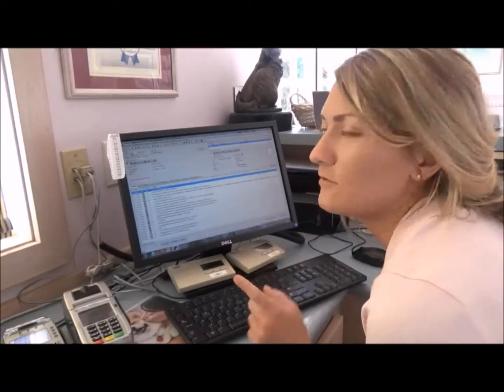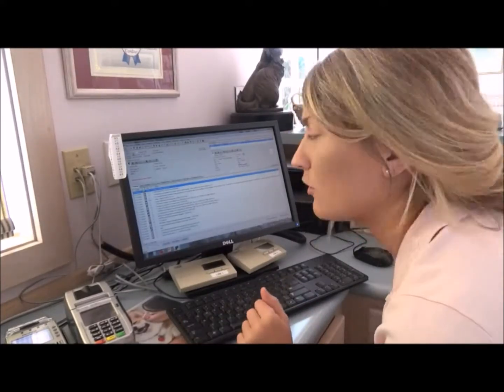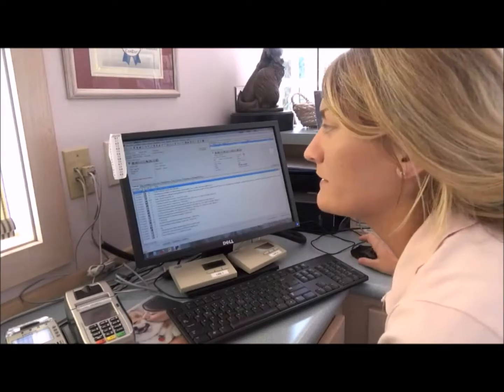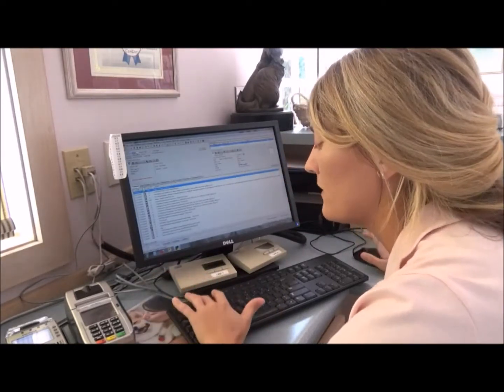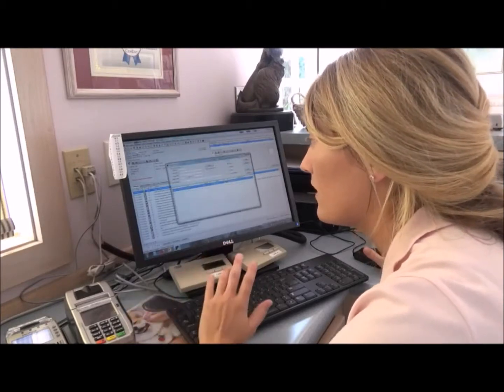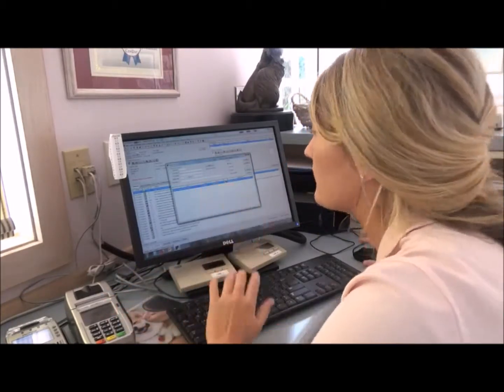Today we'll be performing a canine ovariohysterectomy on a 9-month-old female Jack Russell Terrier who has no known medical problems. Our hospital uses the Cornerstone computer software to hold and organize each patient's permanent medical record. It contains everything you need to know about the patient, and you can easily search for the patient by their name, the owner's last name, phone numbers, email address.